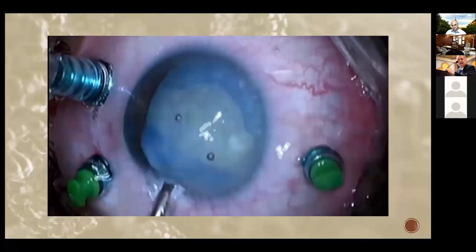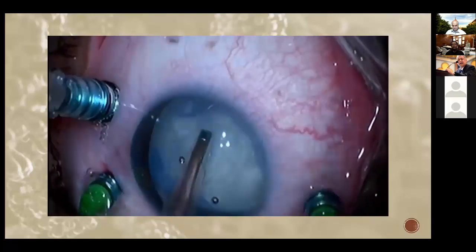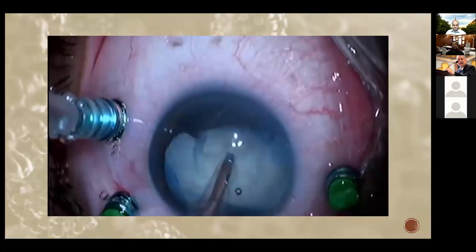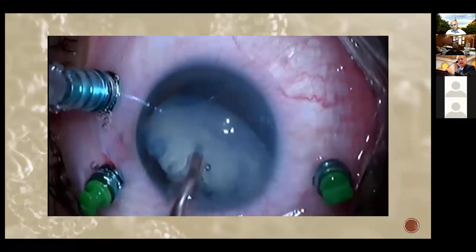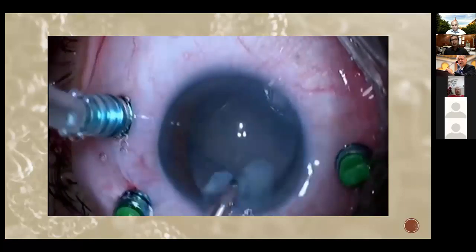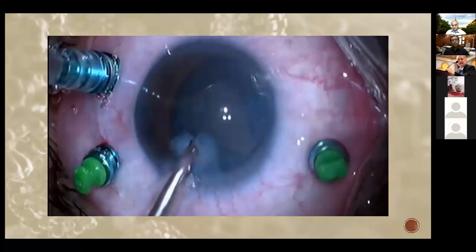I don't need a lot of phaco, and I don't need a lot of fluidics. I don't need a very high bottle. I don't need a high flow rate. I don't need a very high vacuum. All I need is good fluidics flowing in without a lot of turbidity, and vacuum doing the whole job. As you can see, it's a very easy procedure. Vacuum will finish everything just with fluidics, no phaco at all used.